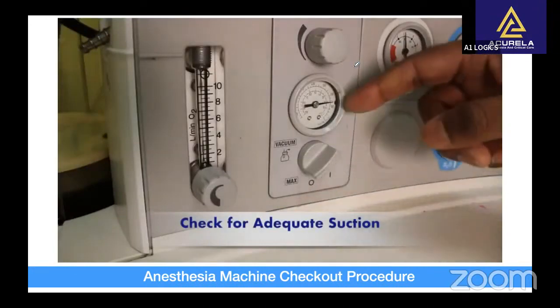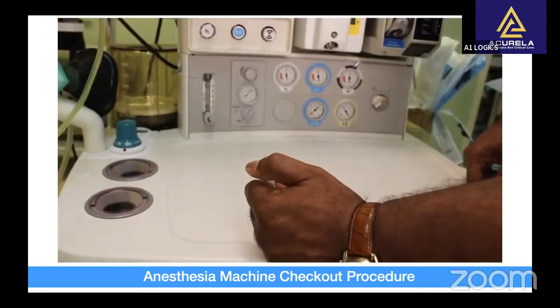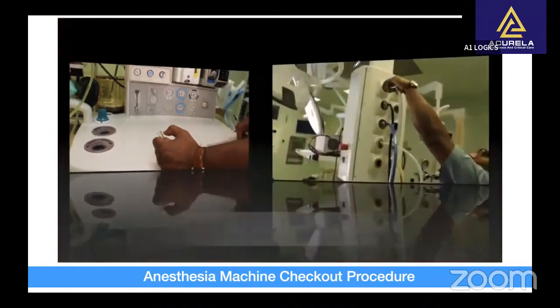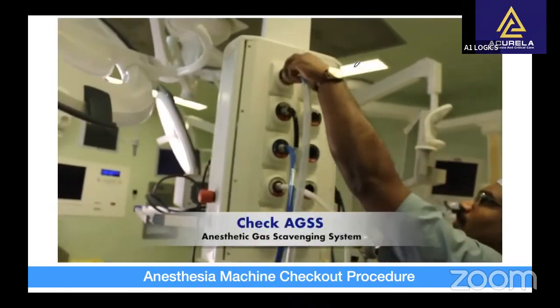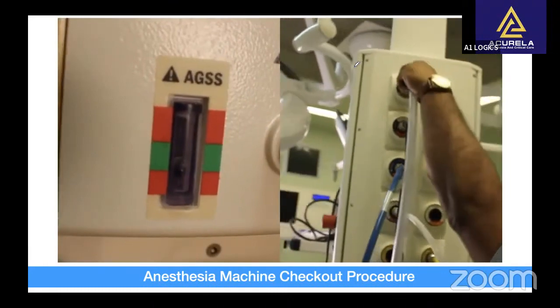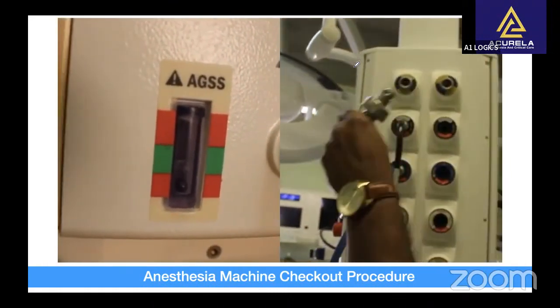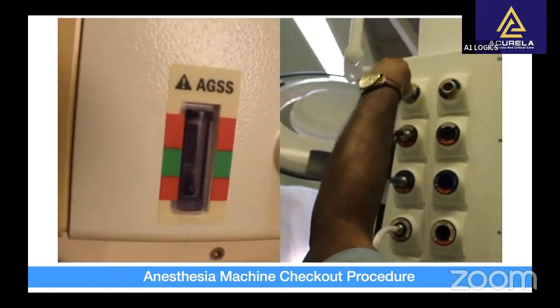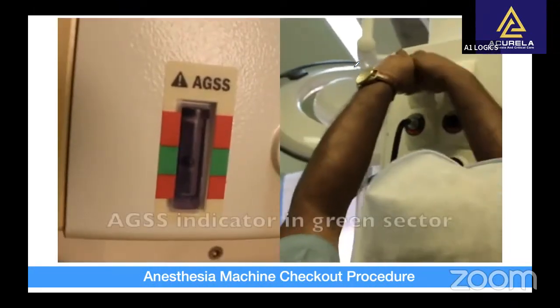Check whether the suction source is connected and the suction regulator provides adequate suction. See if the scavenging circuit is appropriately connected and switched on. The AGSS indicator should be in the green sector.